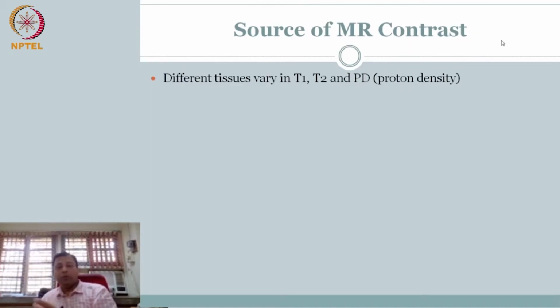So there is a time to echo that we talked about. So that is under our control. Third one is, similar thing. After time to echo, after the excitation is off, then I have to repeat the experiment. So how long do I wait before it all comes back to equilibrium, and then I repeat the experiment. So time to repeat, right? So that is under your control.